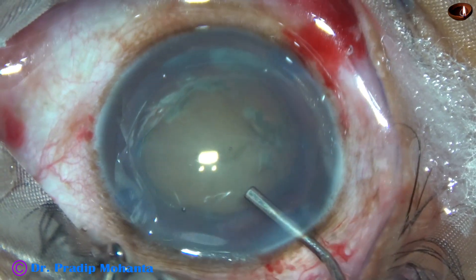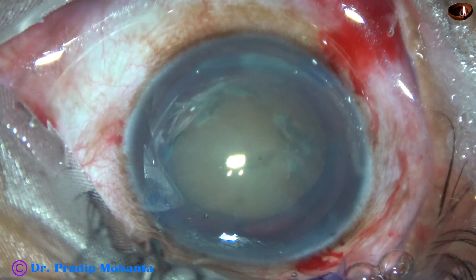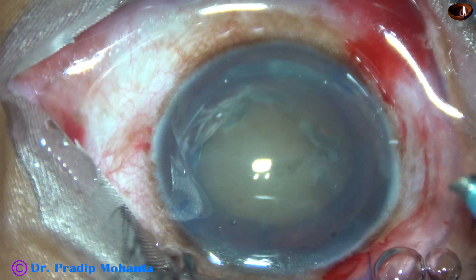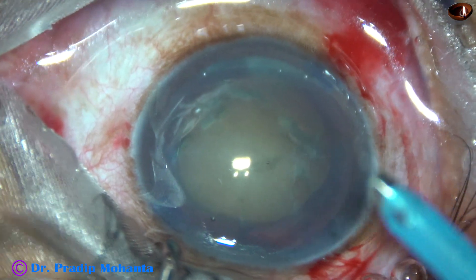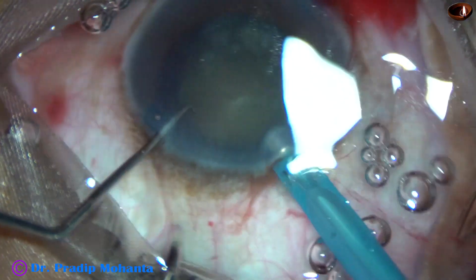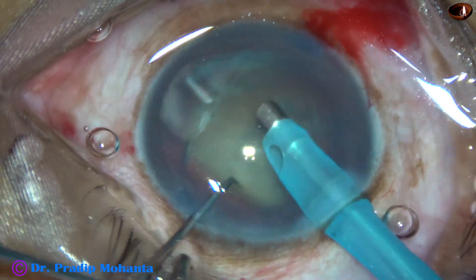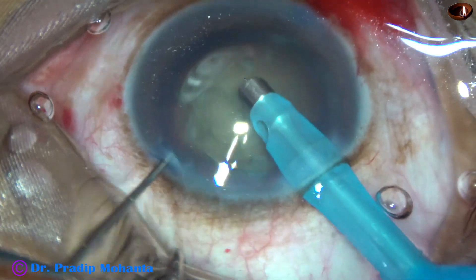Visco is again applied inside the anterior chamber. Now is the time to introduce the phaco needle. The machine being used is Oertli Catarhex 3. The phaco needle goes in, bevel down. Some superficial cortical lens matter is removed.